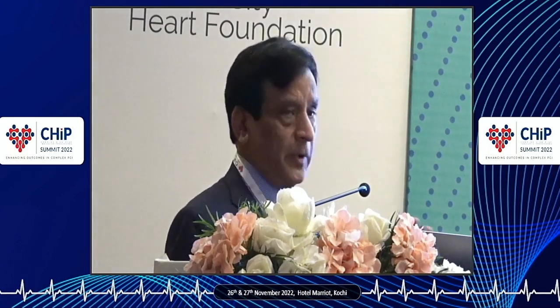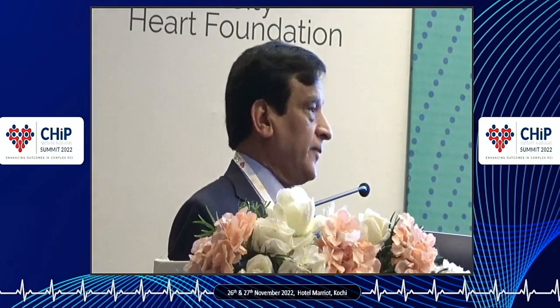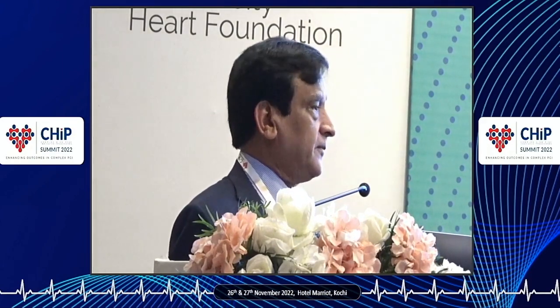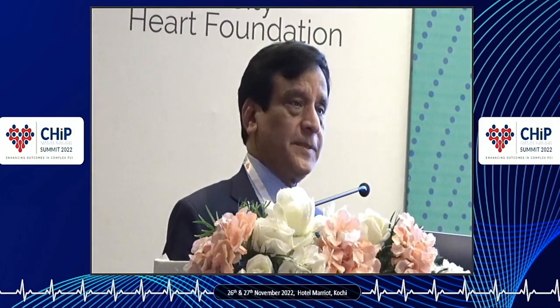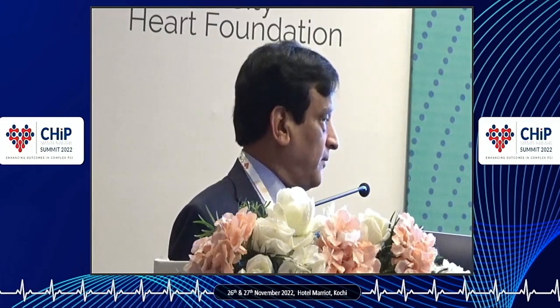If your high pressure balloon has done the job and expanded, you probably don't need the rotational atherectomy. And we know that. In the MACE trial, of the severely calcific lesions, we used atherectomy in only 33%. The other 67% just had high pressure balloon dilatation. Scoring and cutting balloon was only used in 4-5% of cases.